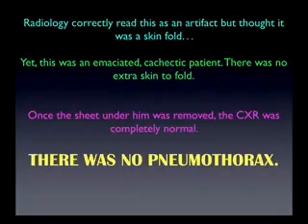Radiology read this as an artifact and thought it was a skin fold. However, this was an emaciated cachectic patient. There was no extra skin to fold. Once the sheet under him was removed, the chest X-ray was completely normal. There was no pneumothorax. Also, no chest tube was placed.